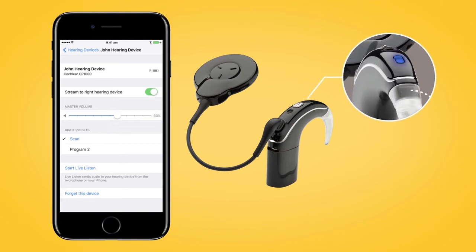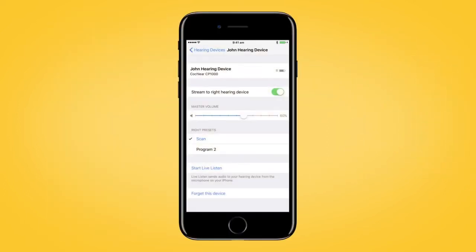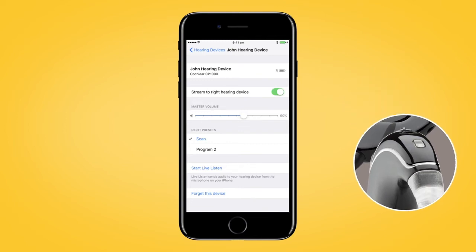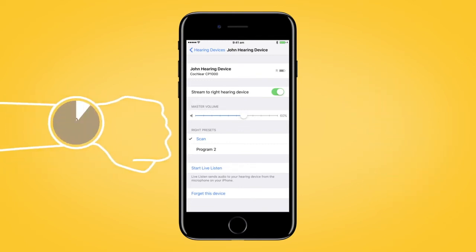You will hear six beeps to indicate that pairing has started. The sound processor light will flash blue for four seconds. The pairing will be finished when you hear a ripple tone and the sound processor light flashes blue for another four seconds. The pairing process may take up to 120 seconds.